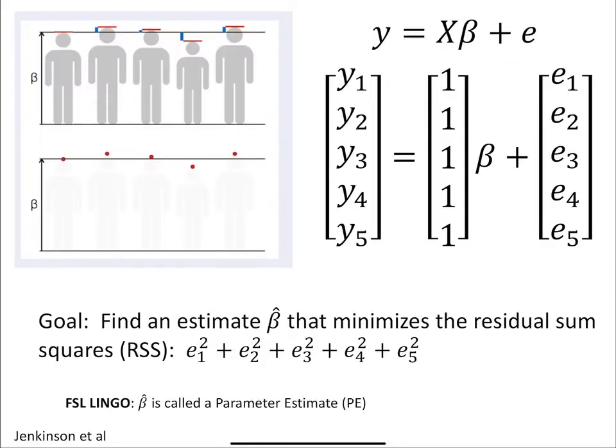Okay, so let's talk about the general linear model for something that's a little simpler, because fMRI data are quite complicated, and it's actually a little easier to get these concepts using a much simpler model. This is from the appendix that's part of your assignment reading. So this is part of the FSL primer appendix. You'll read that primer as part of your reading for this week, but this is one of the figures from that.